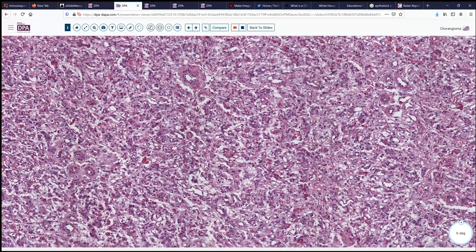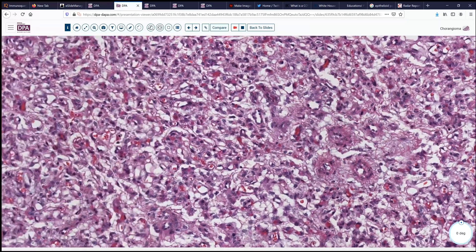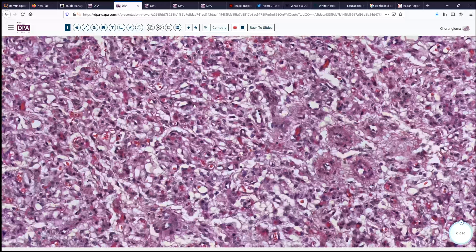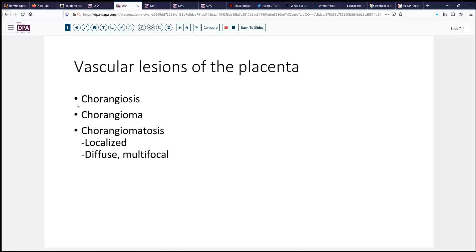So a vascular neoplasm, morphologically, showing a mixture of vessel sizes, and cytologically, fairly bland and uniform. The differential diagnosis for these vascular neoplasms includes several possibilities. We might think of chorangiosis, chorangioma, or chorangiomatosis. Chorangiomatosis occurs primarily in two forms: a localized form, which is probably what we would think of in this case, versus a diffuse and multifocal form.